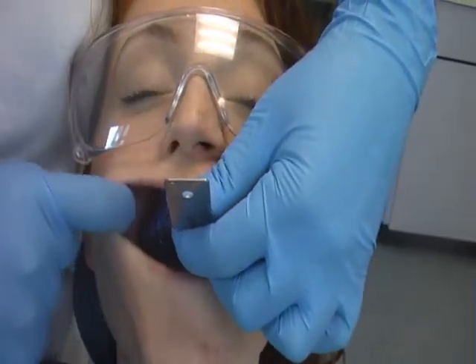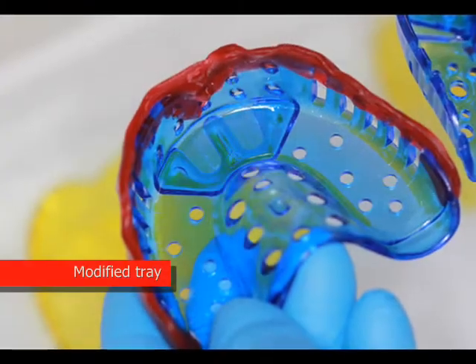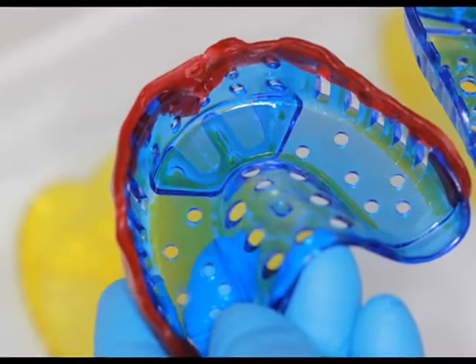Then you can retry it back in the patient's mouth making sure you are satisfied with the adjustment you have made. Note the position of the tray handle — notice how it points downwards and away from the patient's lip.